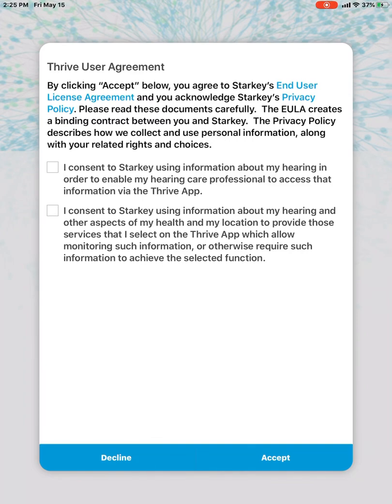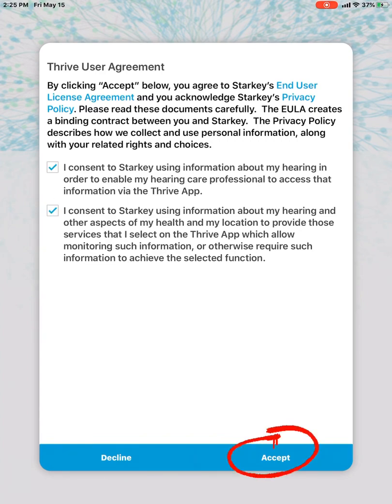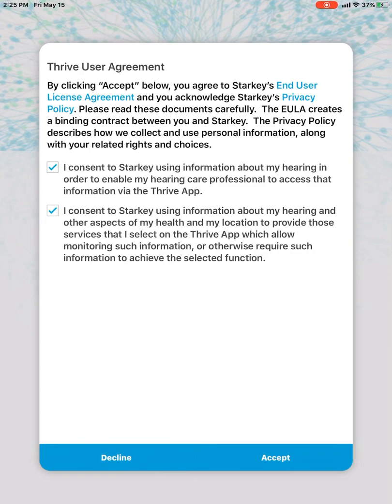Both of those things that are highlighted in blue are links for you to get more information about Starkey's policies. I'm going to go ahead and consent to both of those. And then at the bottom, I'm going to hit accept. You can choose to decline this if you're not comfortable sharing your information. However, some of the features of the app will not be available to you if you do not agree to the full user agreement terms.